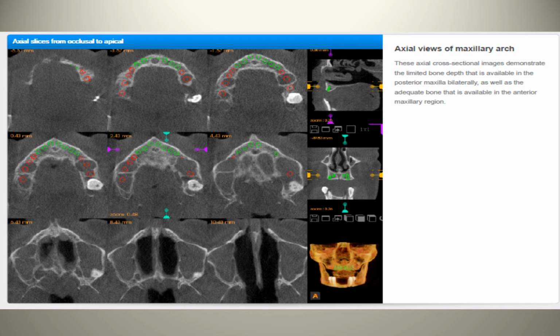If you download these into your own software, you can basically go through these things in three dimensions and check out these areas yourself, which is kind of cool. A lot of these scan facilities like Cataraqui actually provide you with some sort of software which you can download as well and use. And when I'm telling you that these things are available off-site, basically what I'm trying to tell you is that we do not have a cone beam CT scanner in our facility.